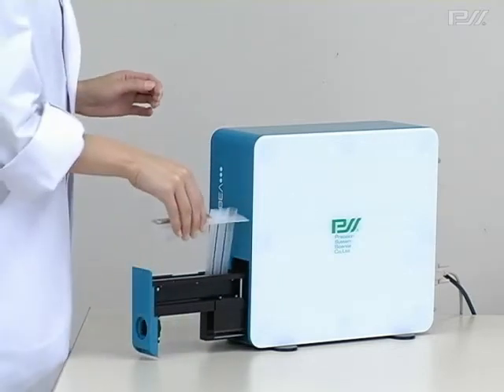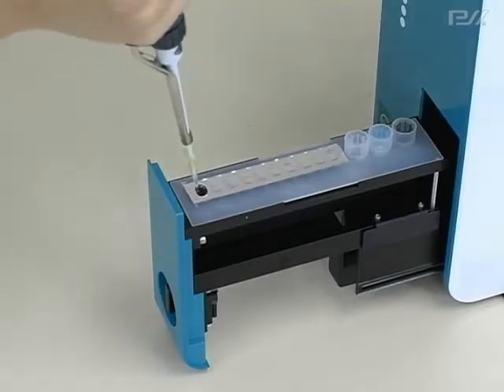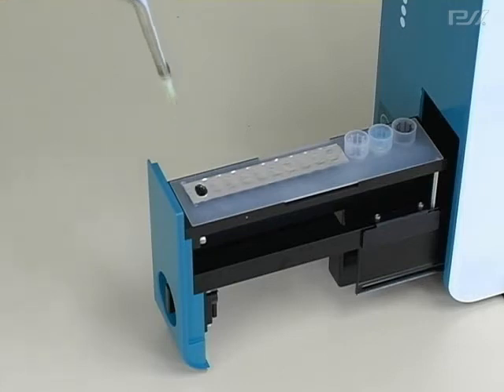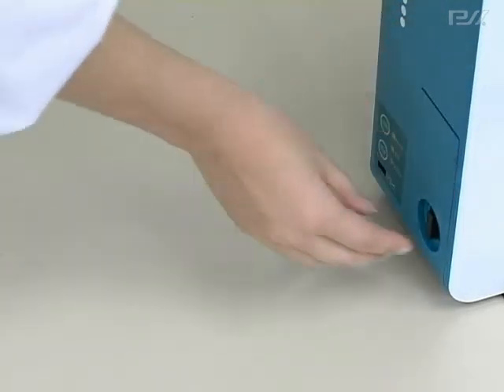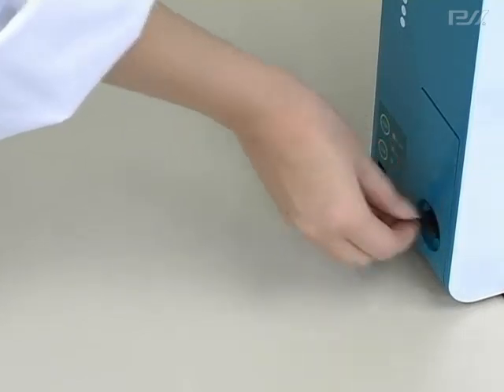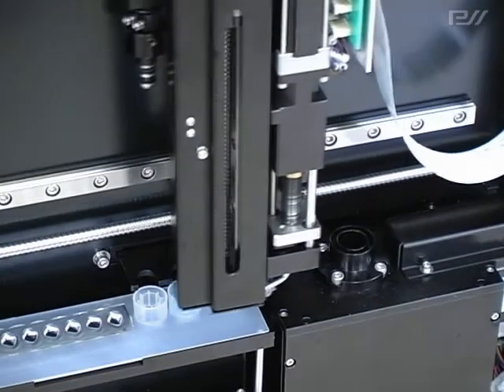First, set the pre-filled reagents cartridge into Lubia. Then dispense sample into the well and push the start button. Then Lubia automatically starts the immunoassay processing. All processing will be fully automatically carried out by Lubia, so that special training is not required.